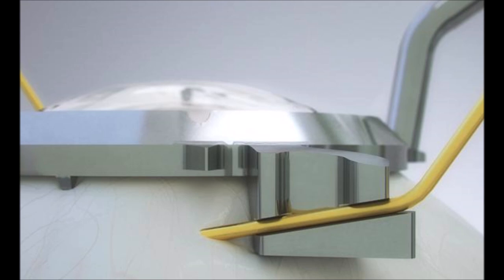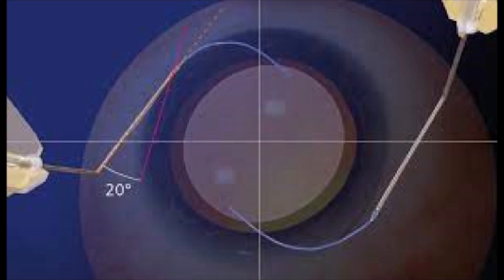It's supposed to allow you to pass the needle through the sclera for two millimeters as it goes in on either side. As you can see here with a 20 degree angle, and as you pull it out, you should have symmetrical needle placement and as a result a better centration with minimal tilt using this instrument.